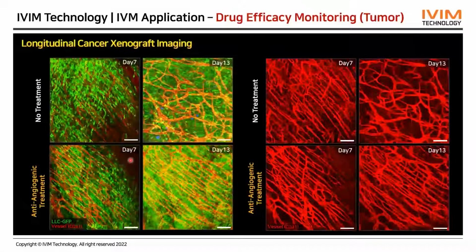And in the wide area, after drug treatment, vessel morphology became more normalized, that is, less dilated and less branched compared to the sham control model. And thereby, in this way, we can finally validate the in vivo efficacy of the anti-angiogenic drugs on the tumor tissue.